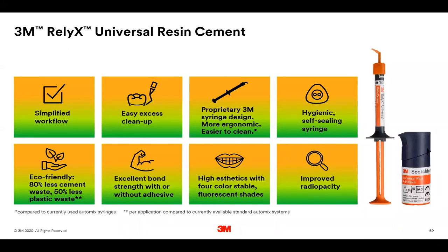The key really, if you're using an adhesive, you need to make sure that it is cured, right? And there's a lot of troubleshooting that you can do to figure out what could cause your adhesive not to cure. One could be you're using a combination where the chemistry isn't aligned. So you're using a brand of adhesive that's different than the brand of the cement.